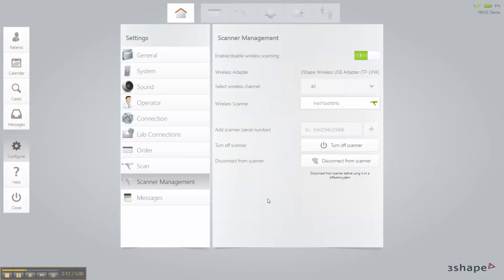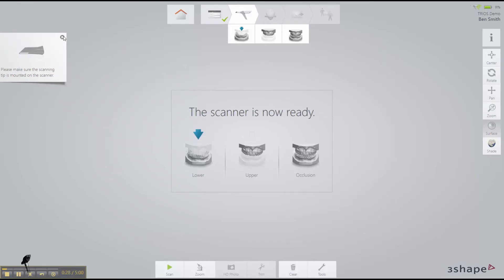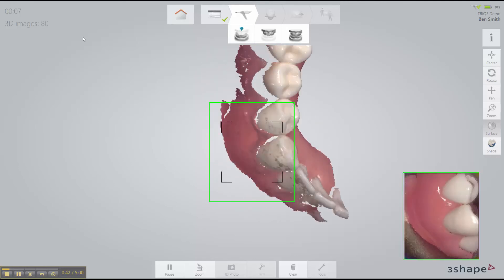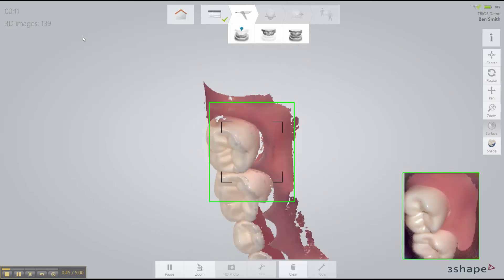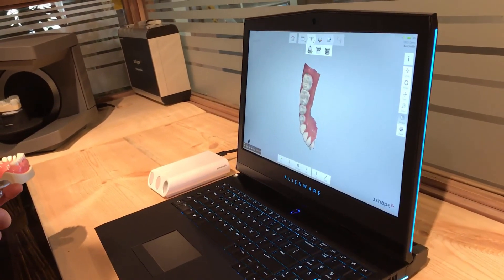Other than that, it goes right into the same usability of the regular Trios software with insane speed. We're just going to do a quick scan now — a study model of the lower — just to show how fast the wireless is compared to the wired. It's literally as fast as I can move my hand. From my experience, the wireless is just as fast as the wired version of the Trios 3.